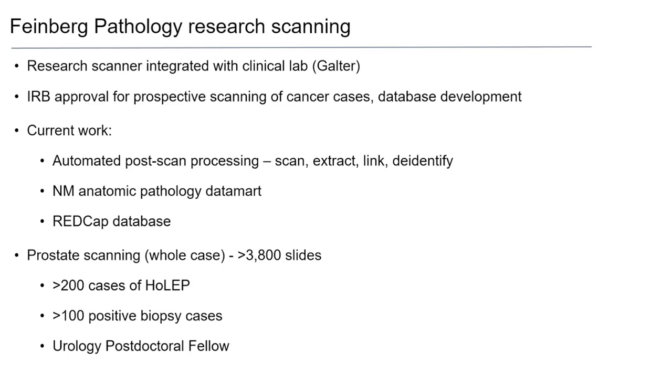For those of you who attended GU ASCO, there was a really interesting presentation by a group from UCSF where they took a few thousand slides for patients who were followed on some landmark RTOG trials like 9202, 9408, 9910. And they essentially were able just to look at these old biopsy slides for patients getting radiotherapy plus or minus hormonal therapy or dose escalation.